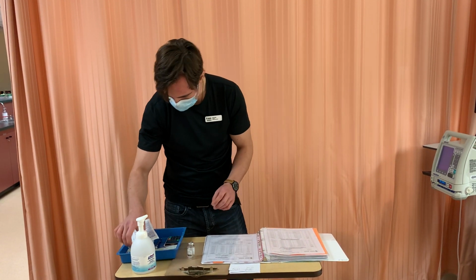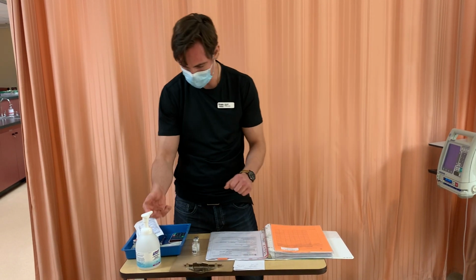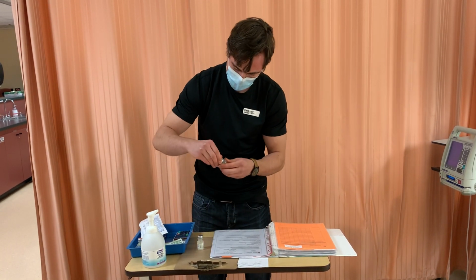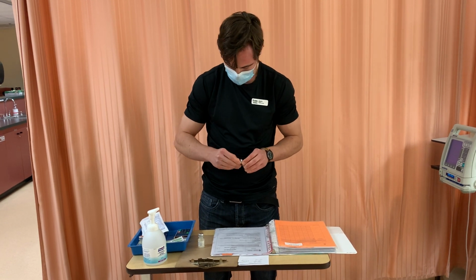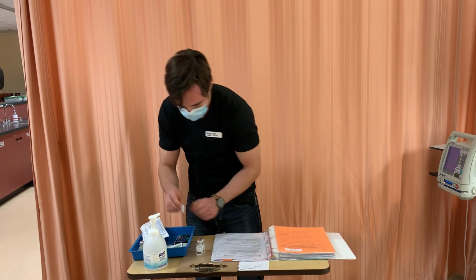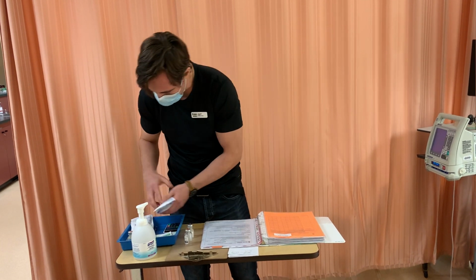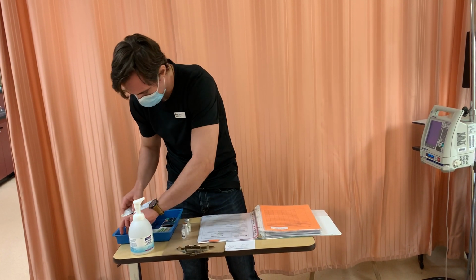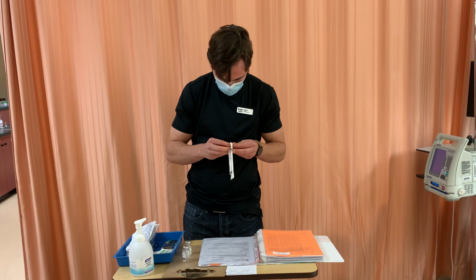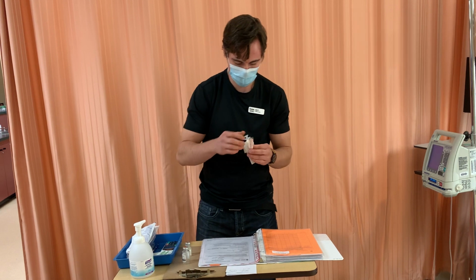Alright, so to start, I'm going to find my sterile water. So I'm going to do hand hygiene again. I'm going to open up the tops of my vials and clean both of the tops for 30 seconds, let them dry for 15. While they're drying, I'm going to open up my syringe, maintaining sterility.